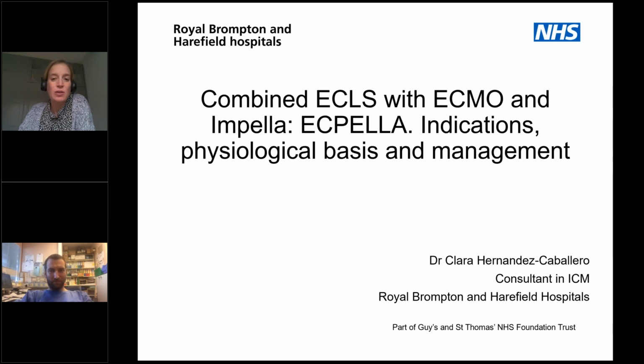I'm going to talk to you about ECPella, or sometimes also called ECMELLA. It's the combination of peripheral VA ECMO and Impella for the treatment of cardiogenic shock patients that need ECMO and develop LV distension. We are going to be talking mainly about its indications, the physiological basis for its use, and what the management of ECPella is.